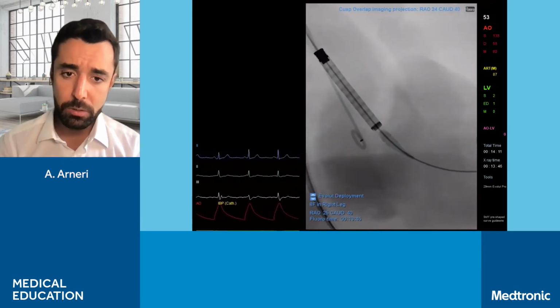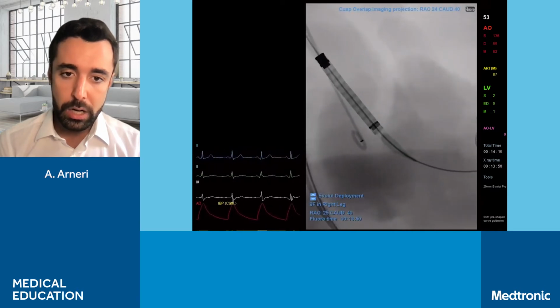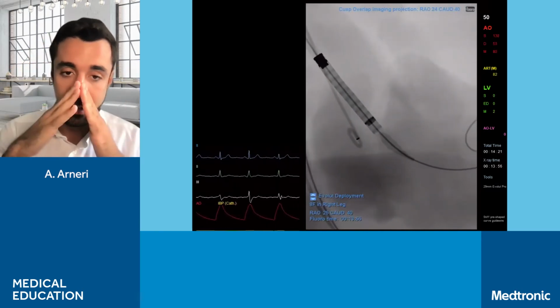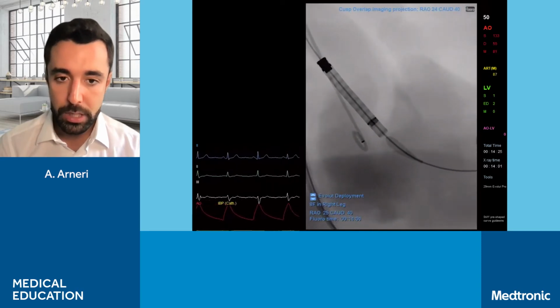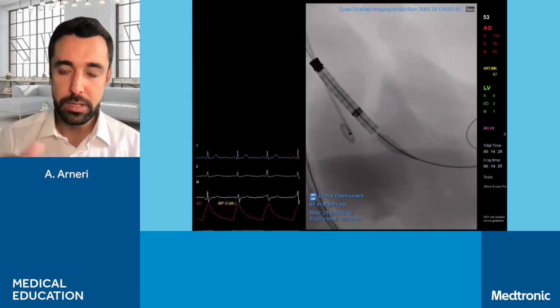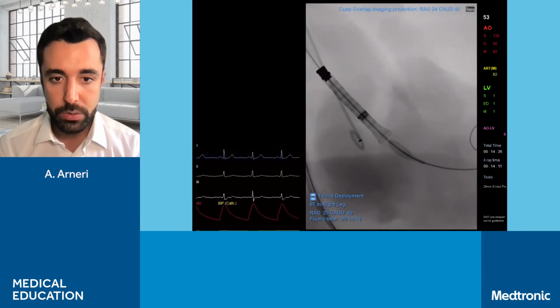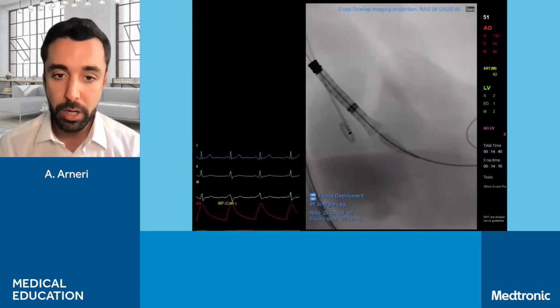Okay, we can start now. So really slow, we're opening the valve. We are, of course, a bit out from our valve, but our system will naturally go a bit into the ventricle by itself. So you don't really need to push that. It's going to naturally move forward a bit more in the ventricle. So we can stop now. We are at 3 millimeter implant depth. Sorry, we are at the third node with the radiopaque marker.